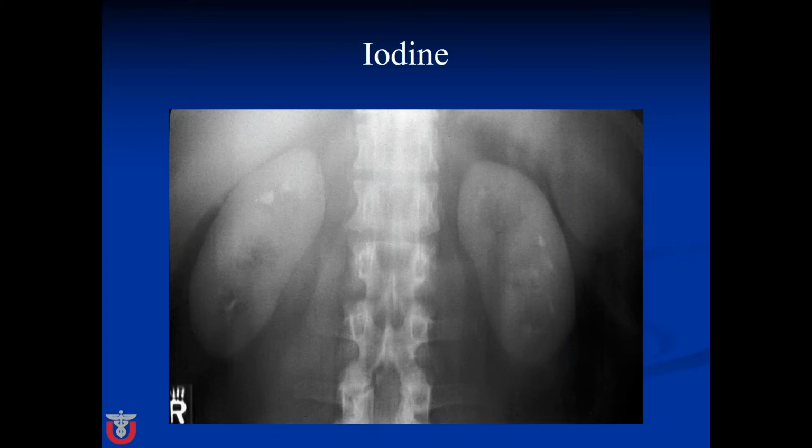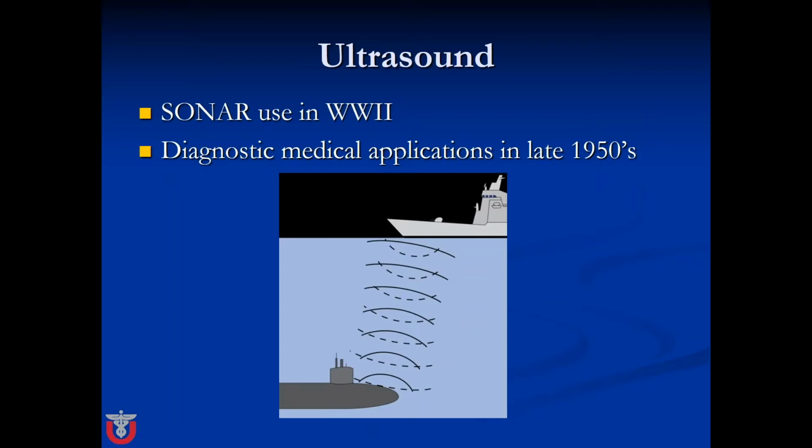So our next big advance, and the hero of our story today, is ultrasound. Now, ultrasound developed directly from uses in World War II. And that's when sonar, which stands for sound navigation and ranging, was used from ships to map seafloors and, most importantly, look for submarines.